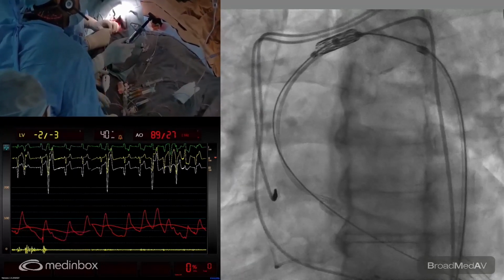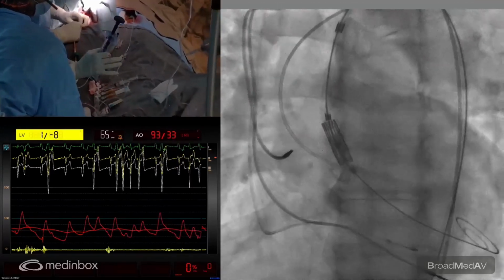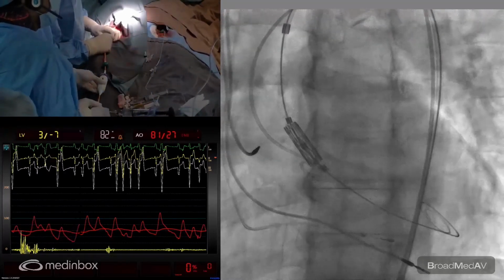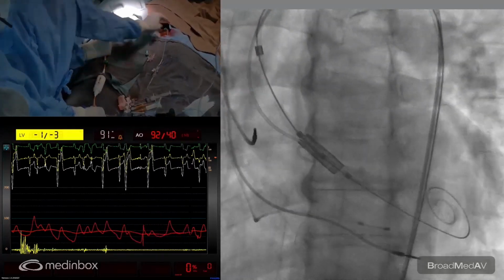Somebody hold the wire back a bit. Be very, very gentle. Okay, so here it goes. Okay. Yeah. So we have crossed.